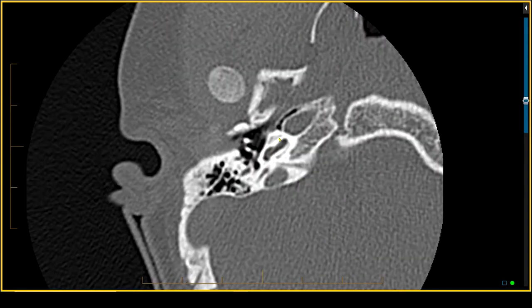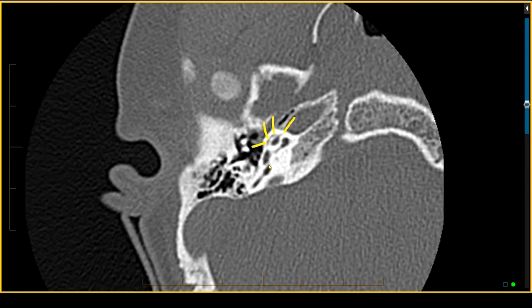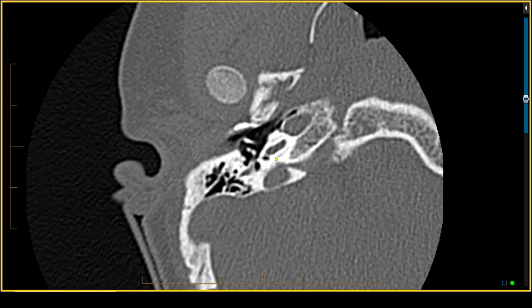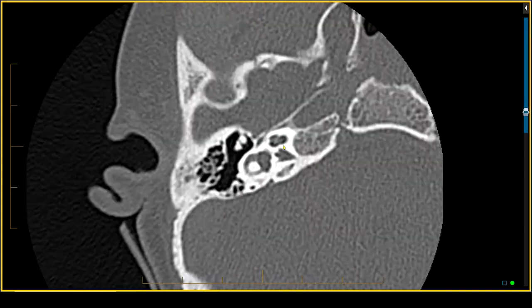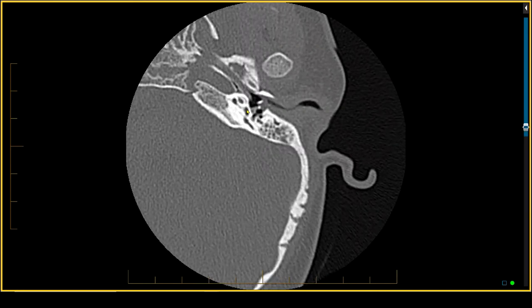Finally, and this is unusual, we note a small halo of low density around the cochlea. This low density of bone is not part of the cochlea itself nor its modiolus — this is an additional abnormality. This patient also has the cochlear form of otospongiosis, seen as this little halo of demineralization around the cochlea. This low density around the cochlea should not be there and is an example of the retrofenestral or cochlear form of otosclerosis, also called otospongiosis.